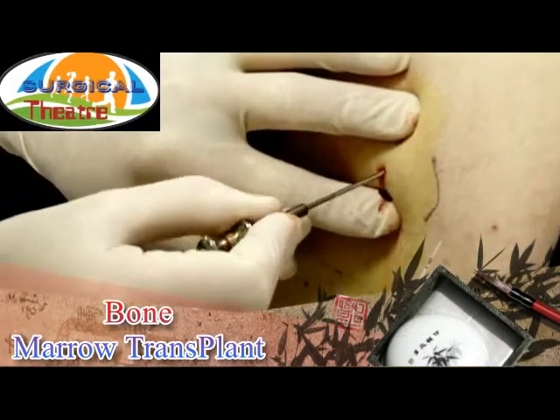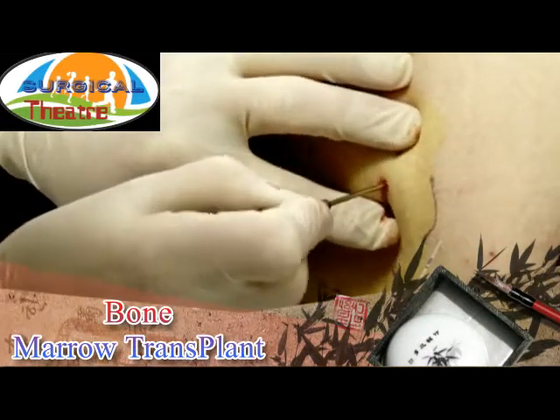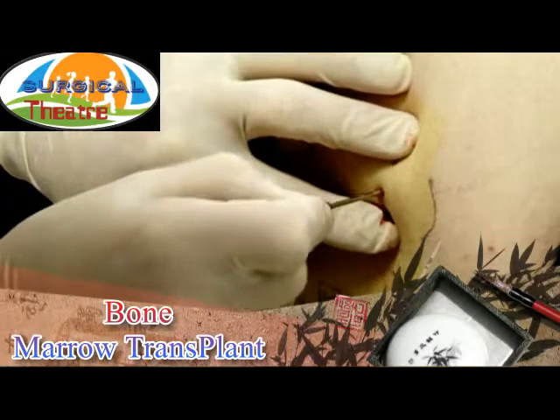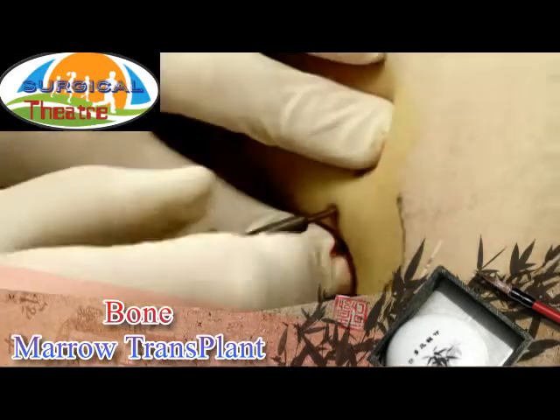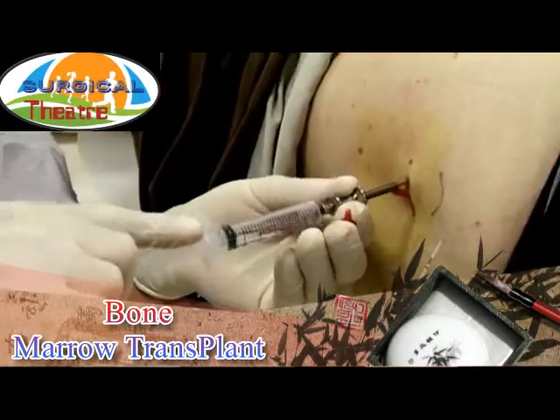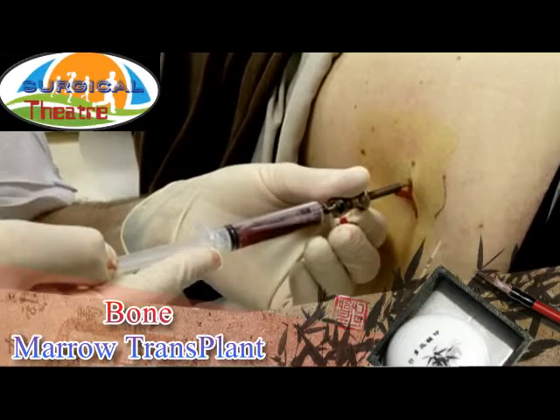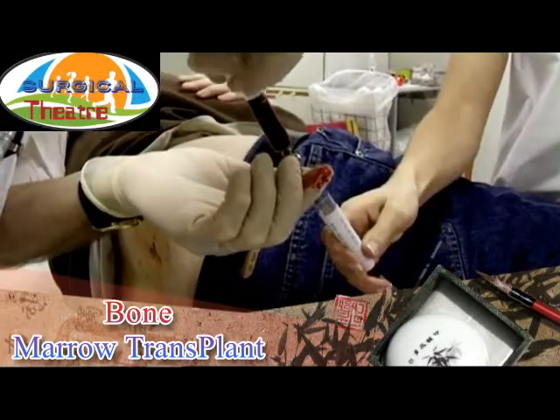A new aspiration needle is used for aspiration for flow cytometry. 0.5 milliliters of heparin is placed in the syringe in advance to stop the aspirate coagulating. 4 to 5 milliliters is aspirated with the syringe, and the aspirate is quickly moved to a specimen glass.